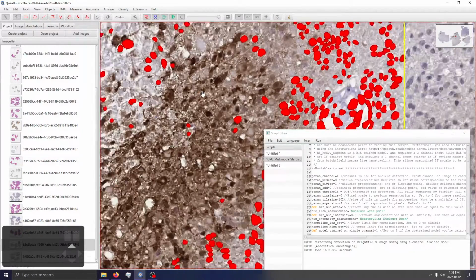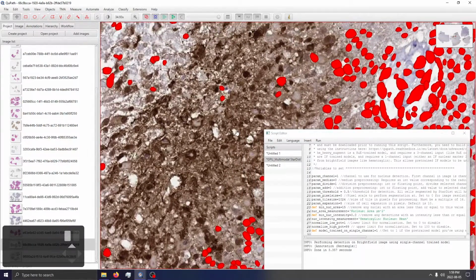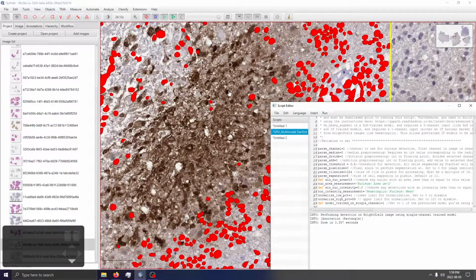Now, it's easy for me to say that, oh, next time, crank down the use of the secondary antibody, or use a lower concentration of diaminobenzidine or whatever. But instead of complaining about the images, which have already been acquired and there's nothing much we can actually do about, let's try and find some solution or creative workaround.